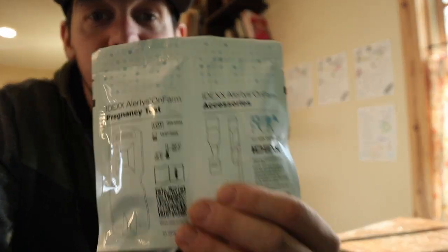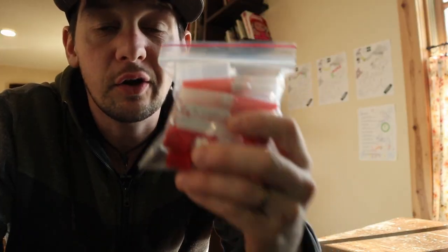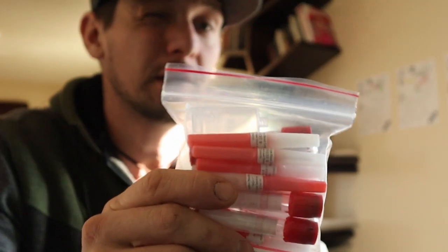This right here is an on-farm pregnancy test, and these right here are the needles that I need to draw blood for this pregnancy test. Let's go see what it says.